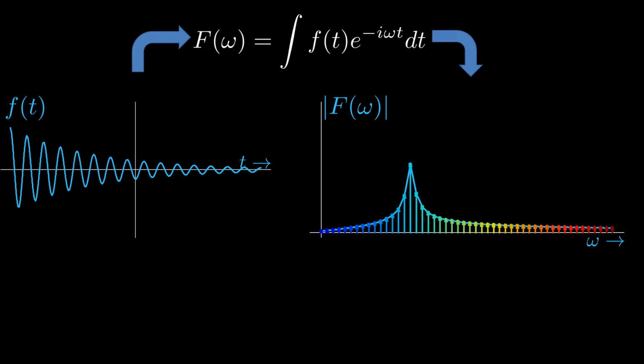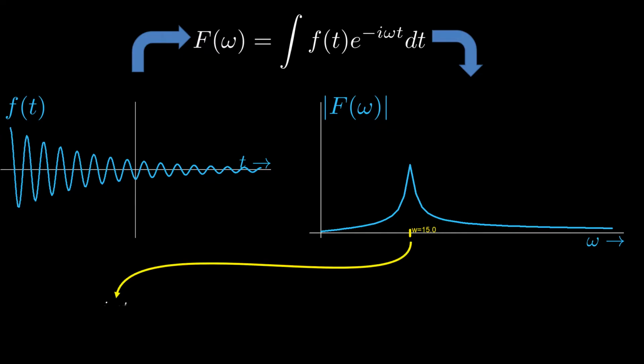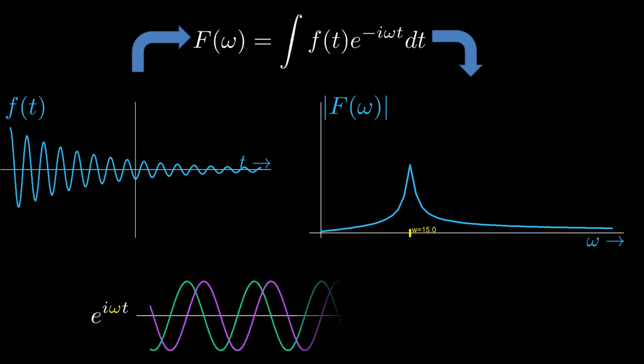The Fourier Transform is a mathematical operation which allows you to represent a function f of t in terms of the different sinusoidal frequencies omega of which that function is composed. That is, you give it a function f of t and it returns the complex function big F of omega specifying the precise phasor associated with every possible sinusoid frequency contained in the function. I really want the connection between these two plots to sink in here. In our big F omega plot, every location on our independent omega axis corresponds to a particular sinusoid of that frequency.